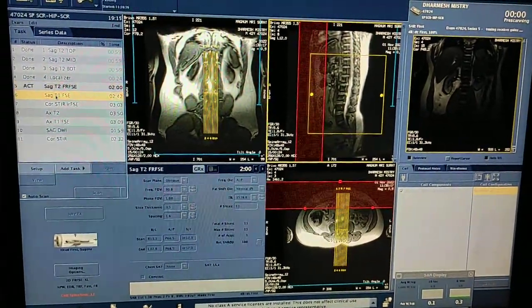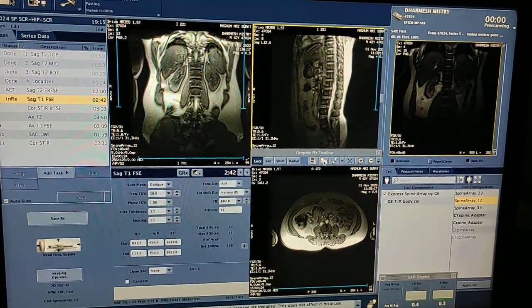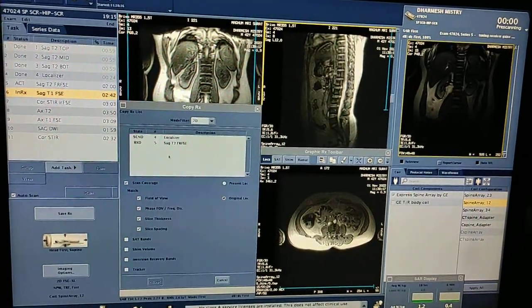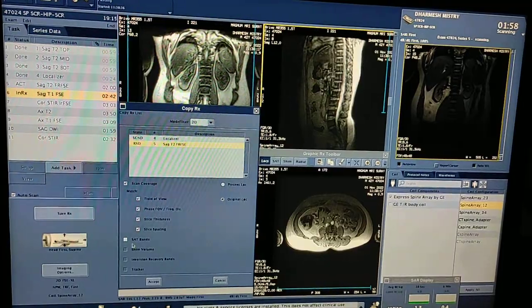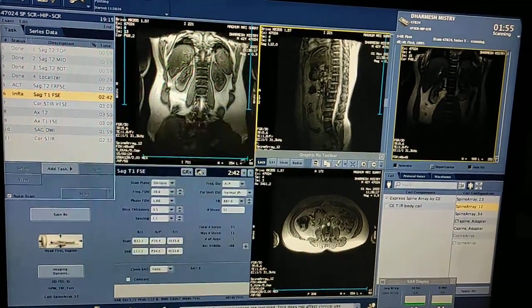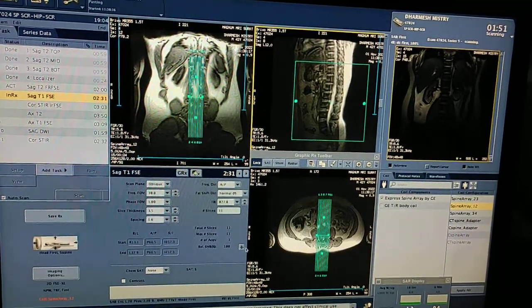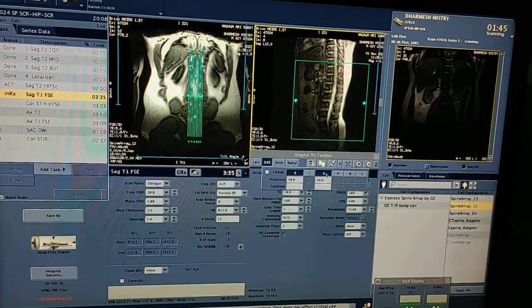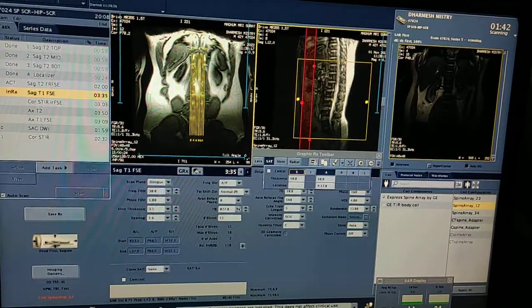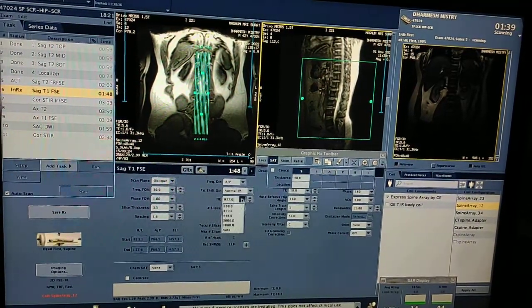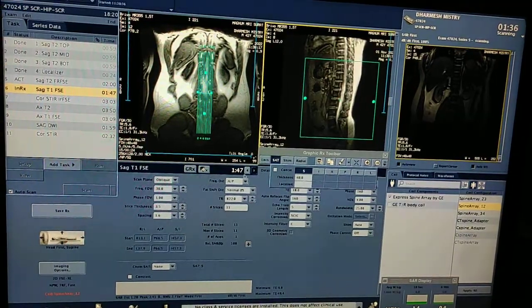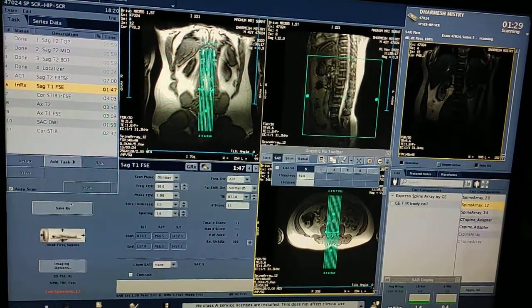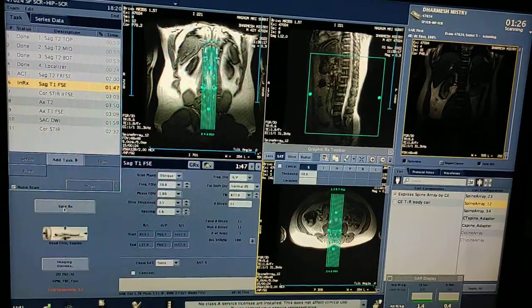Now plan Sag T1. Double-click Sag T1, then from the Rx copy option — the two white pages icon — select Sag T2 to copy the plan. I am not selecting satband for T1 because satband increases the scan time unnecessarily. If you want to keep satband it's okay, but I always remove it from T1. This scan time of about 1:47 is enough. Save Rx.